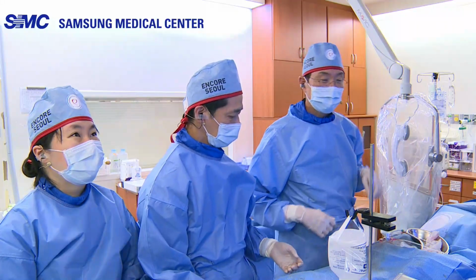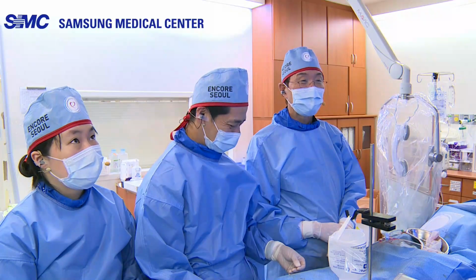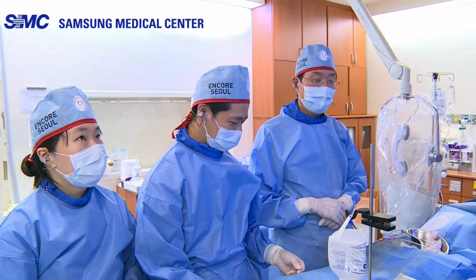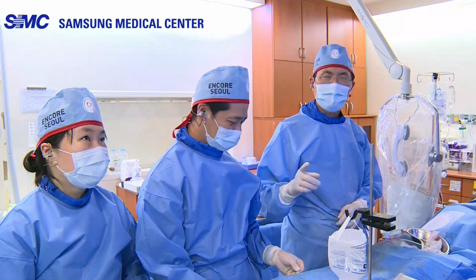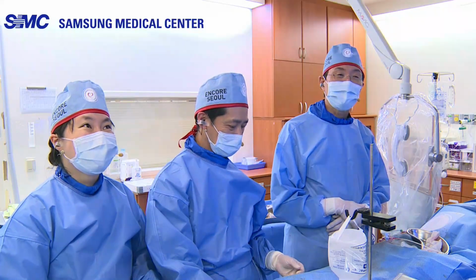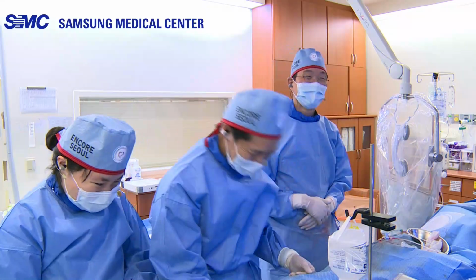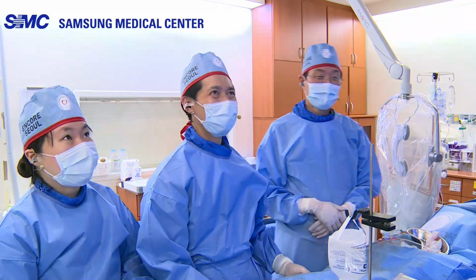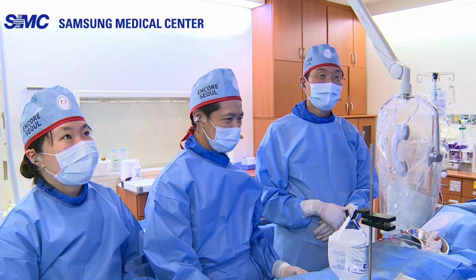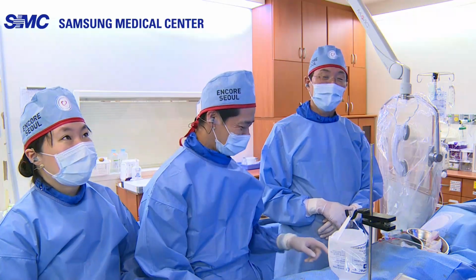What is the DAPT strategy in the balloon angioplasty era? 1 month is enough. And I'd like to add that I still think 1 month is enough. And the final amount of contrast is 33 milliliters. 1 month is enough after angioplasty, but it is not based on any evidence, just arbitrary. But you have to be cautious and nervous, and cannot sleep during that 1 month. It's mechanically dangerous. Yeah, I actually have a sleep disorder.